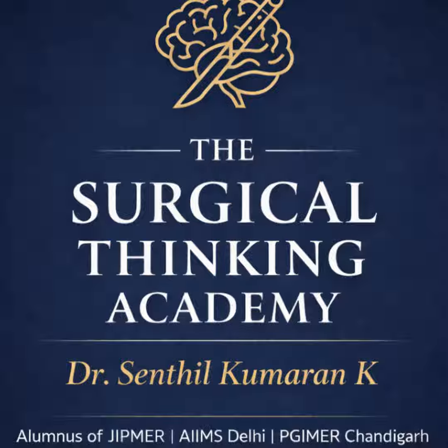Right. What's happening there is the center of the tumor is outgrowing its own blood supply and becoming necrotic. It dies off. So the center is dark. The outer rim is the active growing edge, so it takes up some contrast, and you get this glowing ring with a dark center. And unlike HCC, which often starts as a solitary rebel, metastases usually bring friends.